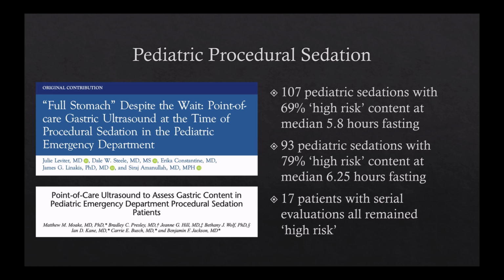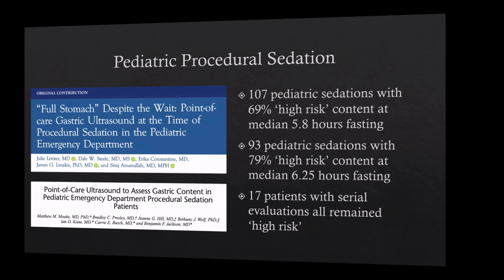The findings of these two studies, in the context of the much larger data set suggesting that pediatric procedural sedation is safe, would suggest that our standard of care pediatric procedural sedation is probably occurring in patients who have high-risk gastric content by ultrasound, and that despite this content, these sedations do in fact end up being safe. Knowing this, there's likely little indication to perform gastric ultrasound in your pediatric procedural sedation patients, except maybe in a few select situations where you have high-risk patients or are performing procedures that are going to be higher risk from an aspiration standpoint, such as those involving the upper airway, or perhaps when considering sedative medications such as propofol that naturally lower your upper airway tone and may be more prone to aspiration.